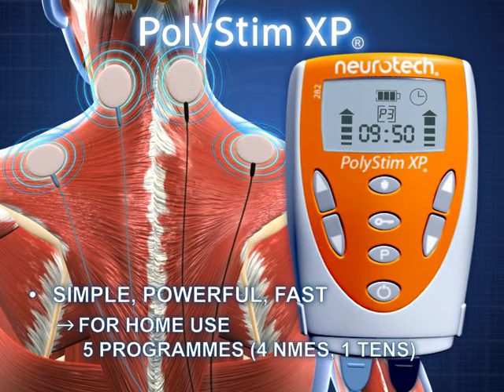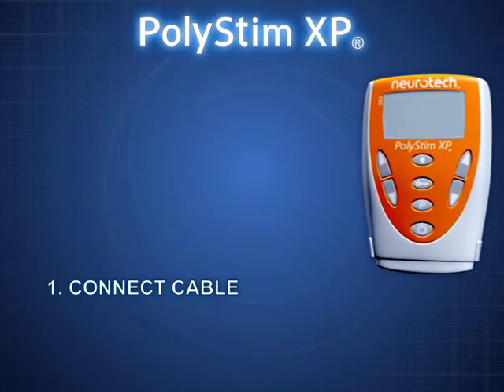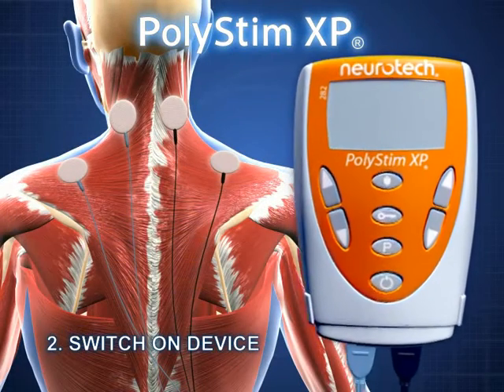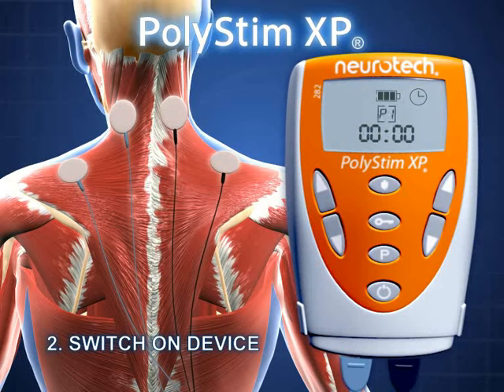The Polystim XP is easy to operate and ideal for treatment at home. Insert the battery and attach the electrodes, then connect the cable to the device. This key is used to switch the device on and off and to interrupt treatment. To switch the device off when the treatment session is over, hold the key down for two seconds.